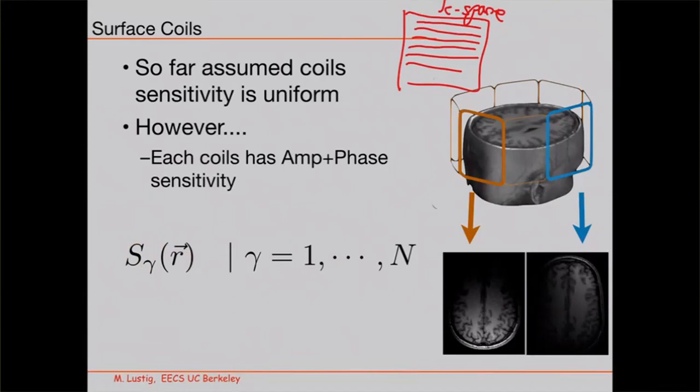So this is one of the sources of phase, actually, in those receiver coils. Because it really depends where a spin position is with respect to the coil. It might pick up, or might induce current in the other way, right? Like it really depends. Whatever spin that is spinning here, it will induce a current with a certain phase at the coil, and that depends on the orientation and geometry of that coil.